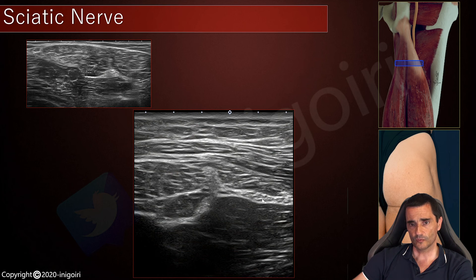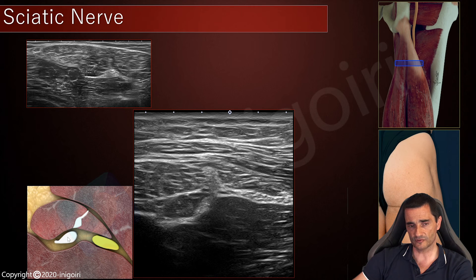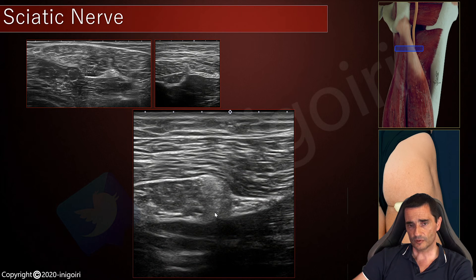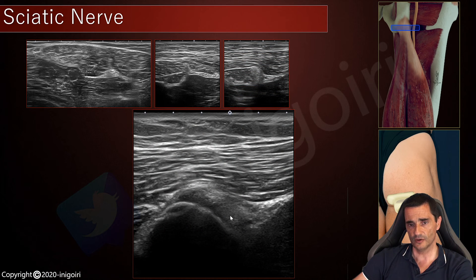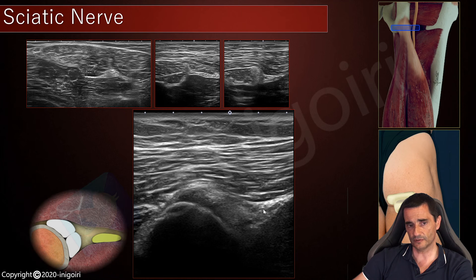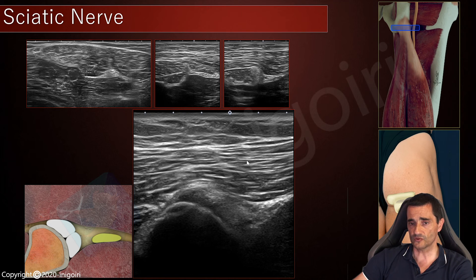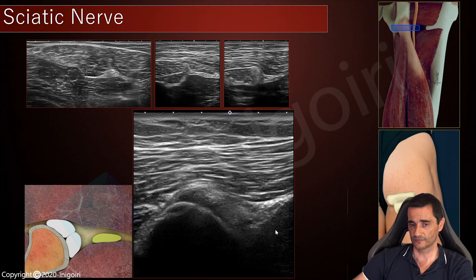As we go proximal, we will see how the sciatic nerve comes close to the tendons — the common tendon and the semimembranosus tendon. The common tendon and semimembranosus tendon are going very very close together, the sciatic nerve is approaching these tendons, and we are very close to the insertion at the ischial tuberosity. The next view is the ischial tuberosity with insertion of the tendons: this is the common tendon, this is the semimembranosus tendon, and this is the sciatic nerve located just here — so this will be the quadratus femoris. This is the same area we just checked in the first approach.